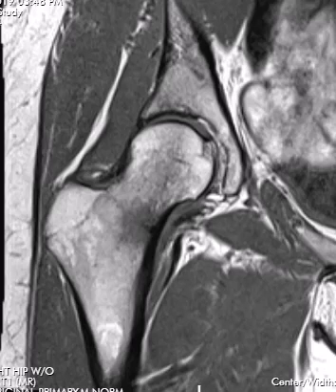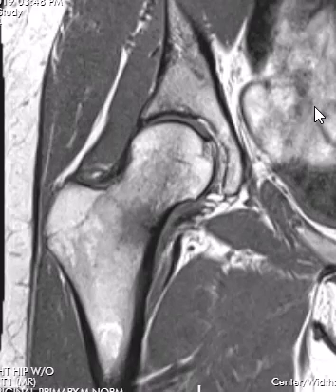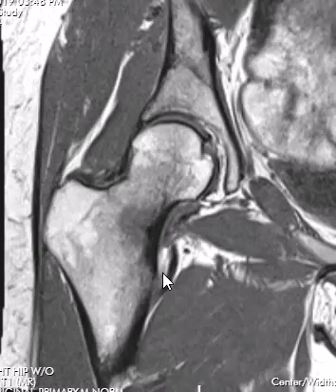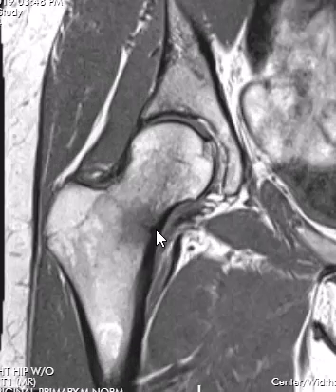Hello, this is Dr. Gay from First Look MRI. This is a female in her late 30s who exercises a lot and is having right hip pain. The doctor thought she may have a stress fracture, and that's exactly what she has. This is a classic bread-and-butter type stress fracture of the right femur. This is the femoral head, femoral neck here, and this is the lesser trochanter and greater trochanter — so this is the femoral neck region.